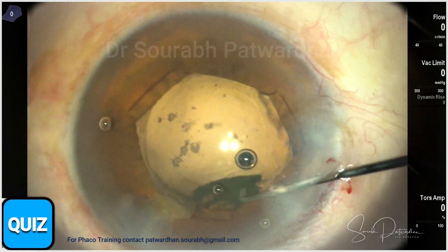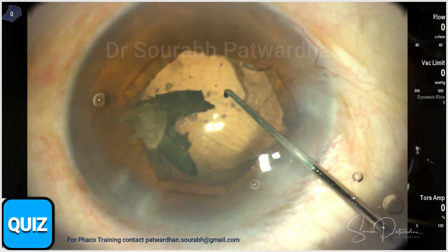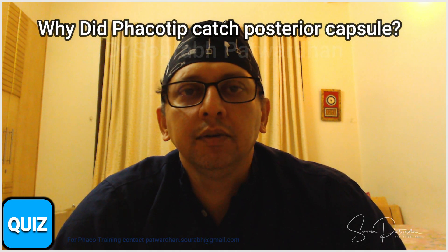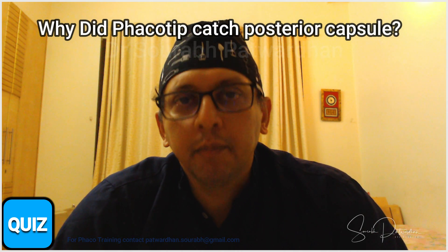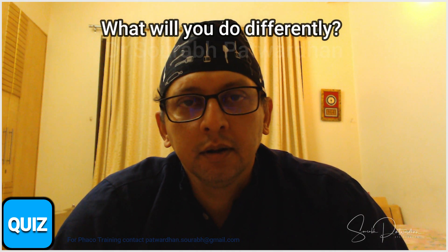That is the case I want you all to review. Revisit and check what was happening throughout. This is a very important quiz. Watch the video again from the beginning to the end, and look for the changes in parameters I made for the last piece. Answer this question: why did the phaco tip catch hold of the posterior capsule despite the change in parameters? Was there a surge during the last piece?